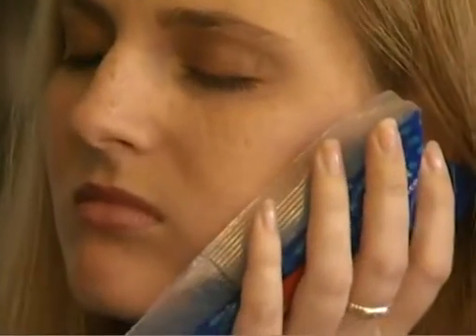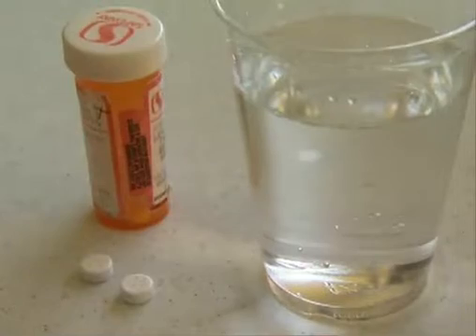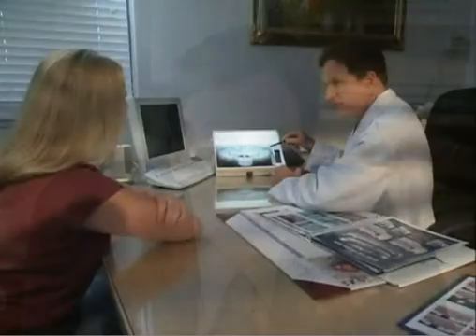It may take some time to heal. You'll be given detailed instructions to help deal with these occurrences. These can include ice packs for the swelling, pain medications for the discomfort, and methods to control bleeding. If patients experience more than moderate discomfort, excessive bleeding, or have questions, they should call for additional consultation and direction.